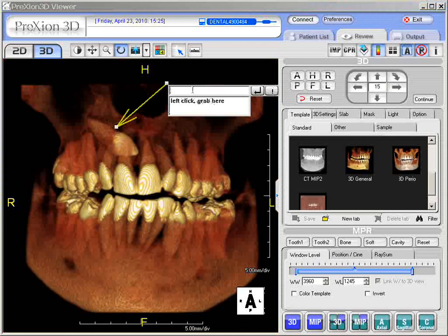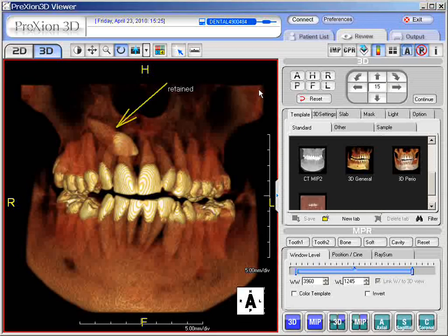Here you can say whatever you wish to say. We'll just call this 'retained tooth' and press the Enter key on the keyboard, and then you have an arrow.